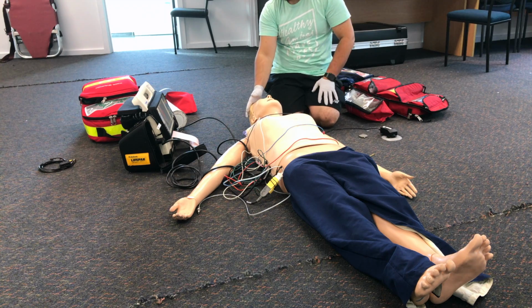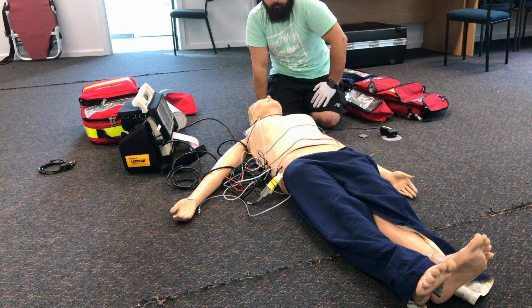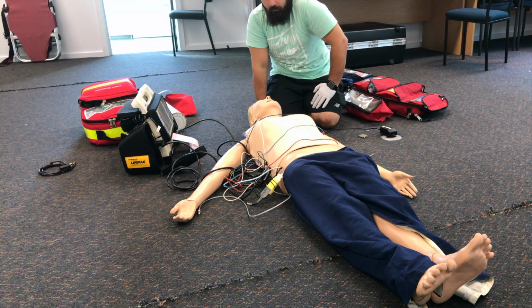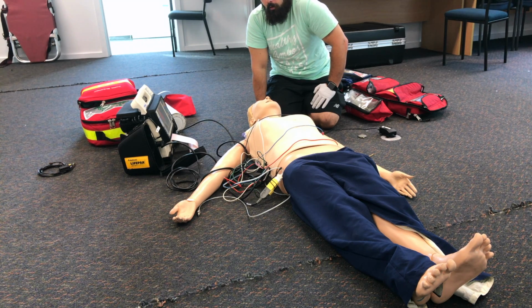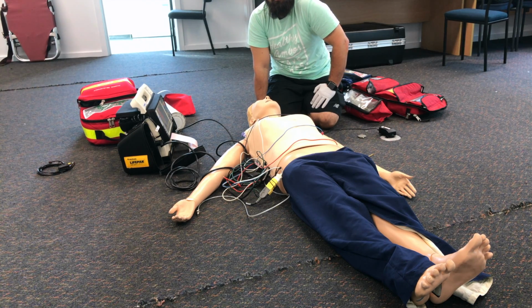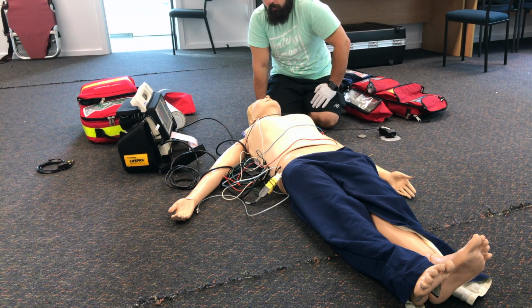Now that we've paced this patient, I would expect his GCS to possibly increase, so I'm going to give him some low-dose ketamine and fentanyl as sedation and analgesia. If the pacing were to fail for this patient, we would move on to an adrenaline infusion, where we just put 1 mg of adrenaline into a 1 liter bag of saline and run that at a rate of about 1 to 2 drops per second.